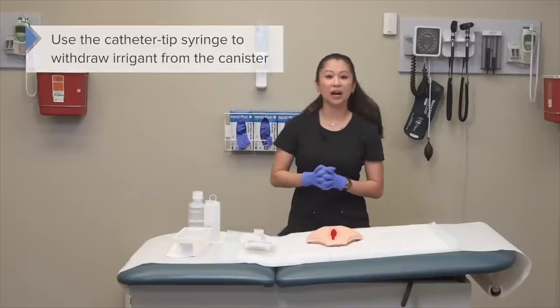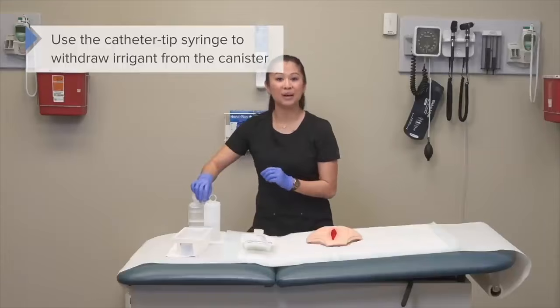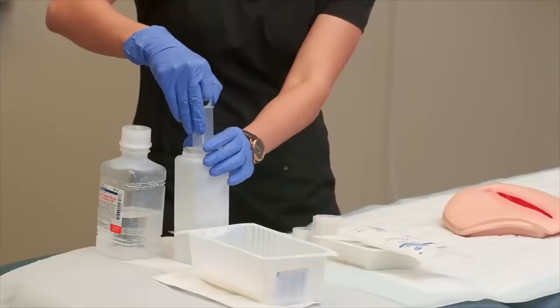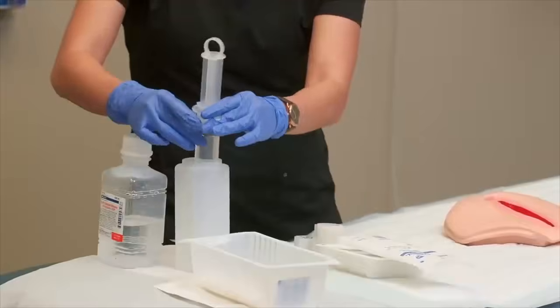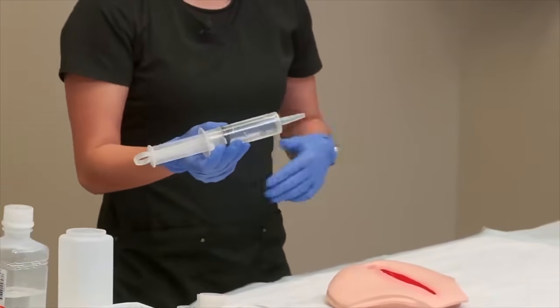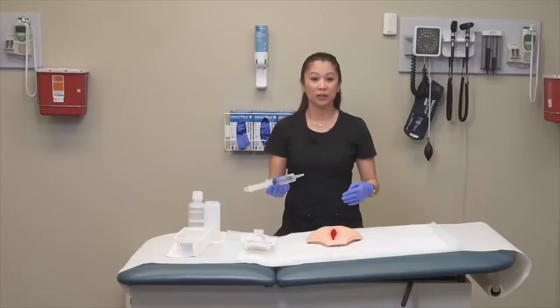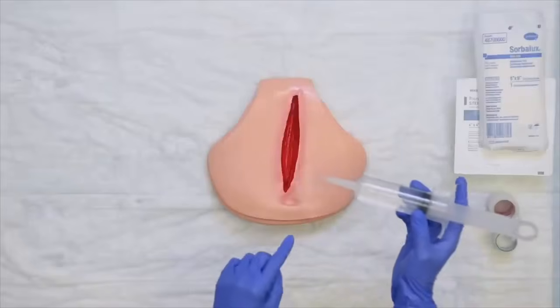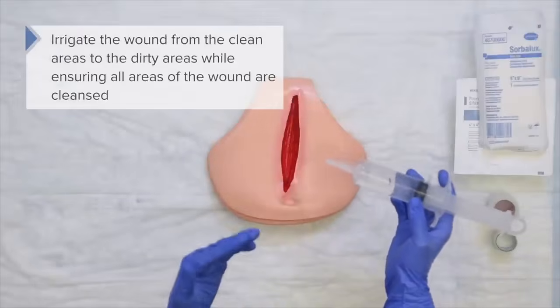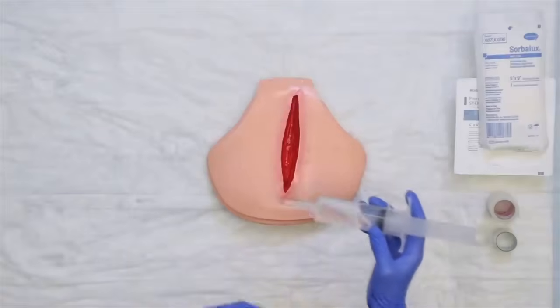Okay, so now I've got my irrigant fluid poured. I'm going to take my catheter tip syringe and pull up my fluid. As you can see here, I have ample fluid for irrigation. Now, I'm not going to show you today. You kind of get the general gist, but we'll talk through the irrigation. So when I'm irrigating, I'm going to go from the cleanest area to the dirty. Typically that's going to mean I'm going to irrigate the wound bed, then we're going to go around.